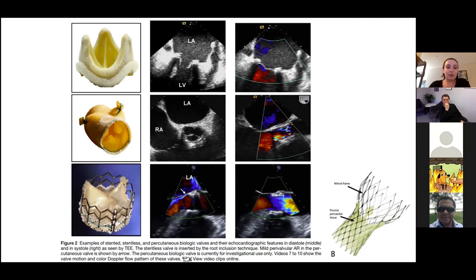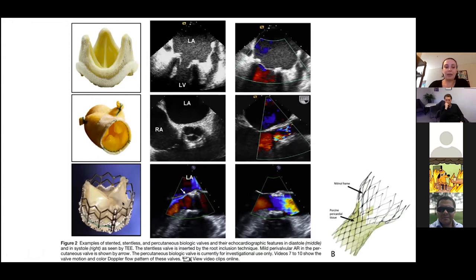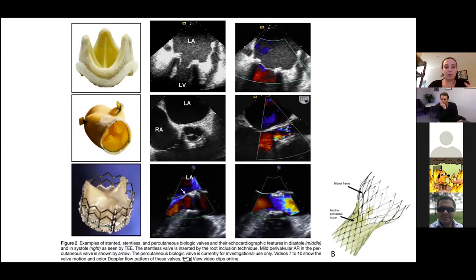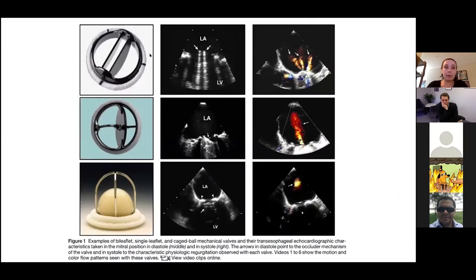The last two are examples of percutaneous valves. The first is a stented one and this one is a self-expanding type. These are not the only kinds of percutaneous valves but they pretty much all look like that — the self-expanding ones are always the longer ones, and the ones that already have a stent around them are a little bit shorter. And these are the mechanical types of valves.